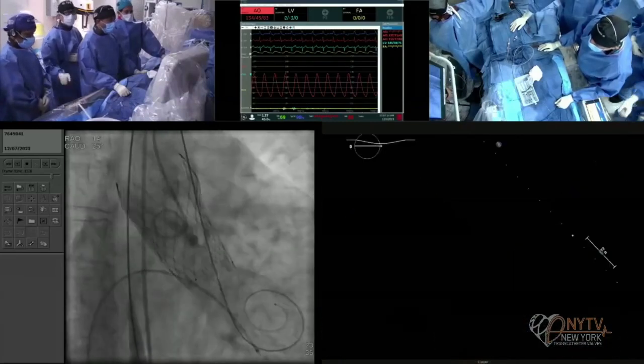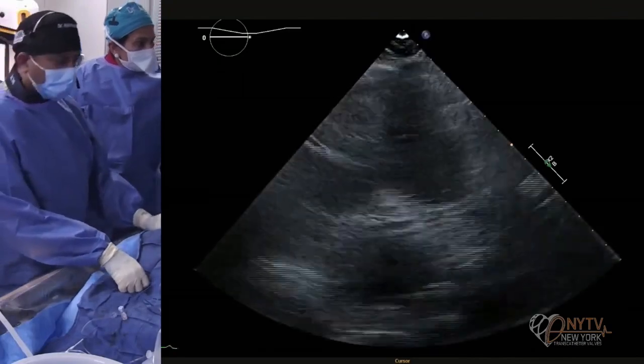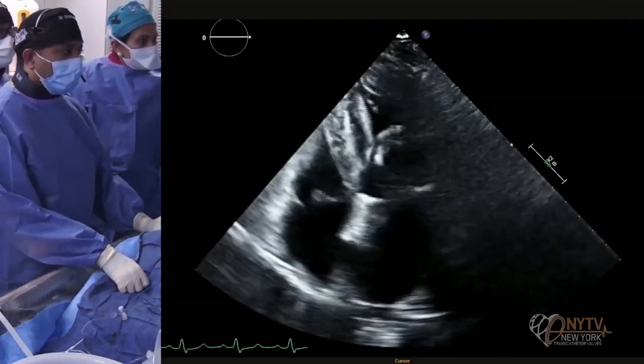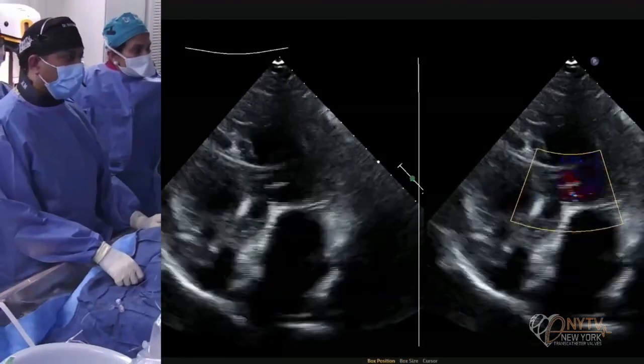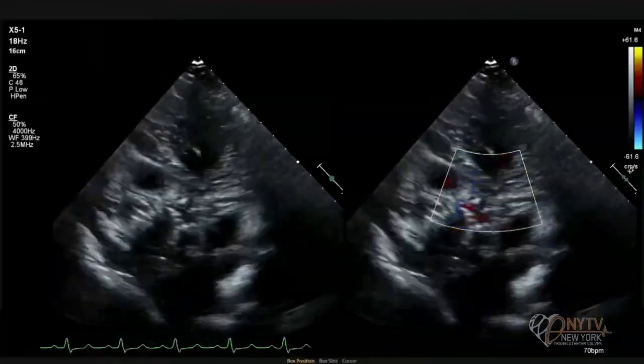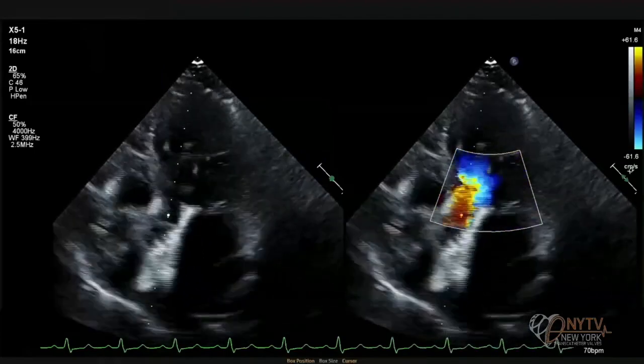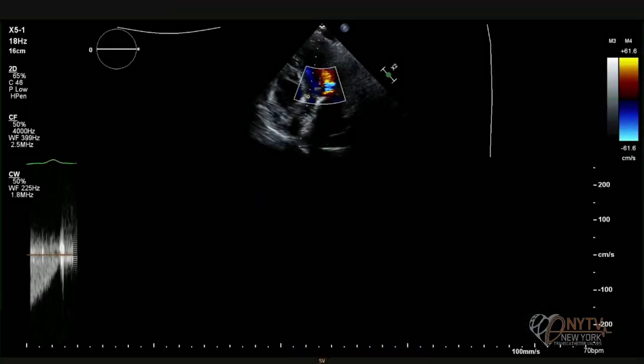So we're very happy with it. How does it look, Lucy and Hafiz? So far it looks great. Speak up, please, Lucy. Sorry, I couldn't hear you. So far it looks great. We have a pigtail across, right? Yep, there's a pigtail across. There's very minimal posterior. Looks great.